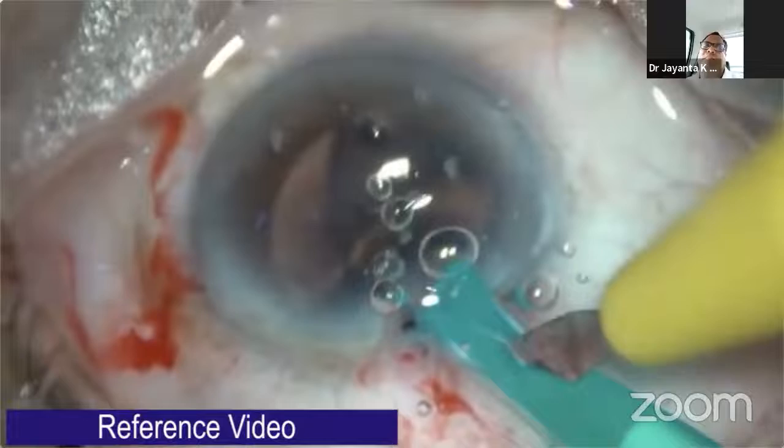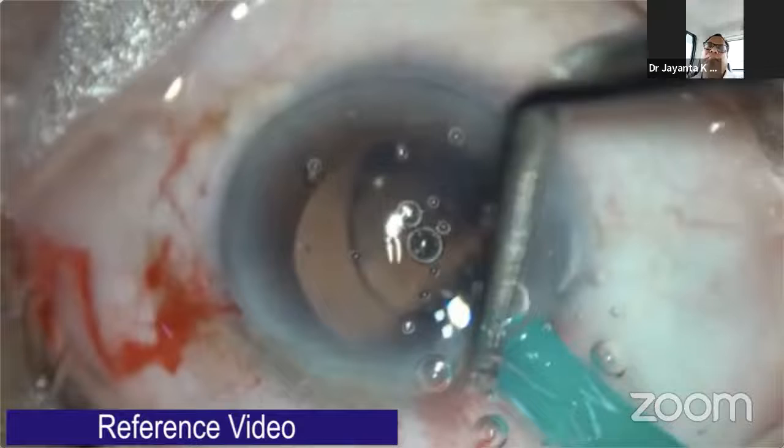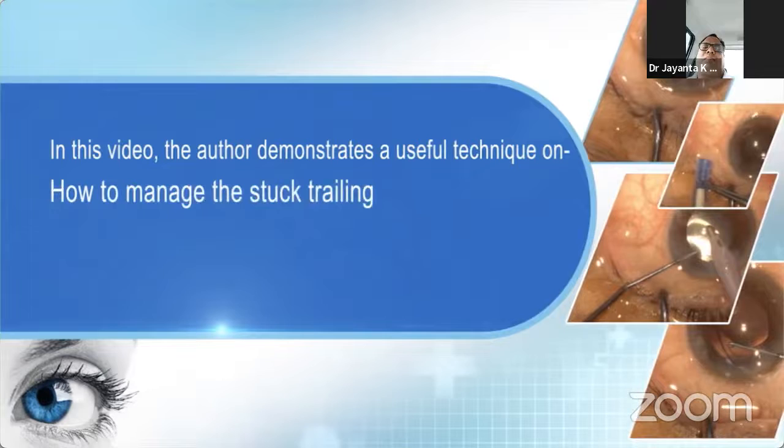Later, a lot of surgeons adopted this technique, but I feel this technique was also not very promising. Most of the time, surgeons need an extra instrument to release it manually. By this step, sometimes the haptic may be injured during manipulation.